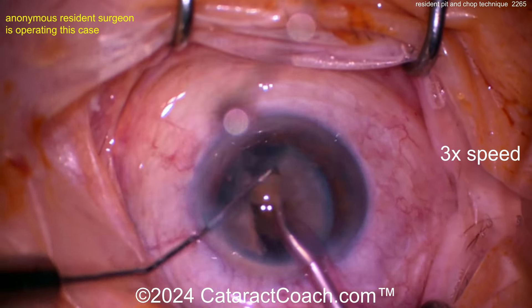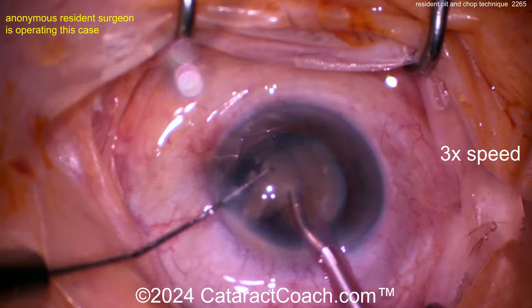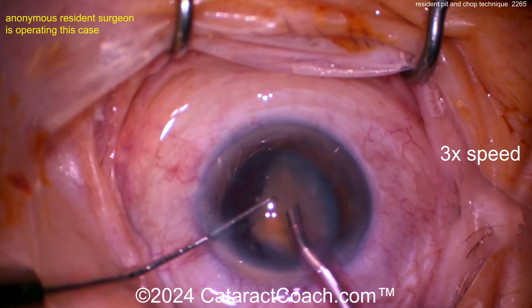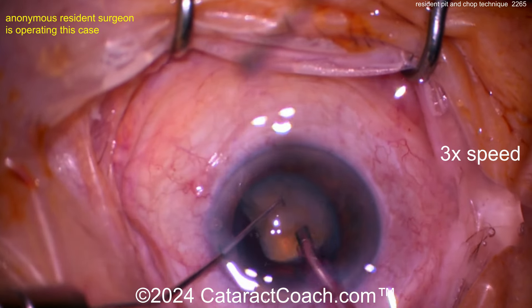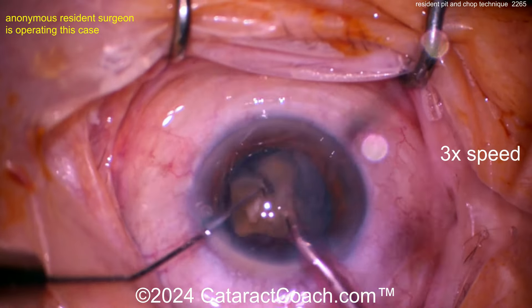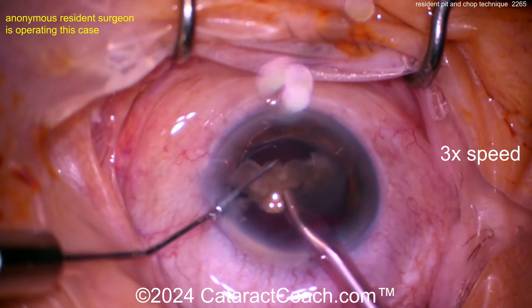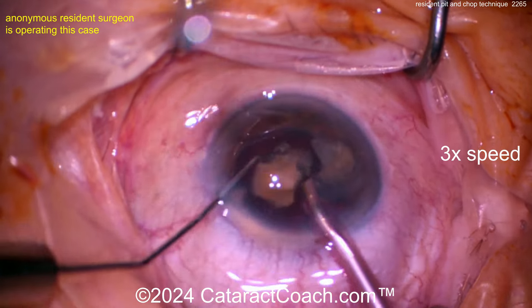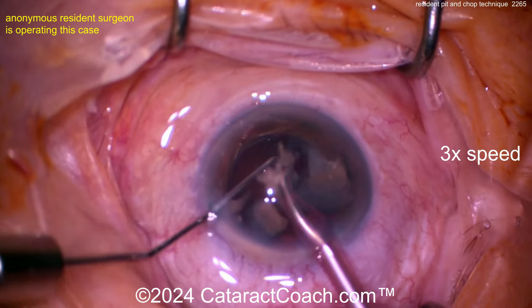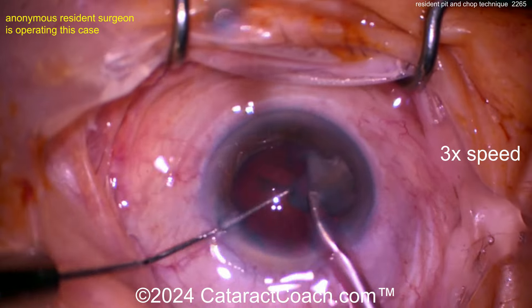You can do divide and conquer as your preferred technique — whatever you like. But in my history of teaching residents, any resident who could learn chop like this really ends up preferring it, and it's more fun. If you were doing divide and conquer, that's okay too — it's whatever you like. But I encourage you to try to learn chop. If you try phaco chop and still want to go back to another technique, go for it. But in my experience, if you try it, you'll love it.